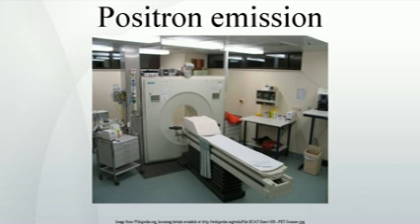A few other isotopes and radiotracers are slowly being introduced into oncology for specific purposes. For example, 11C-metomidate has been used to detect tumors of adrenocortical origin. Also, FDOPA PET-CT, in centers which offer it, has proven to be a more sensitive alternative to the MIBG scan for finding and localizing pheochromocytoma.